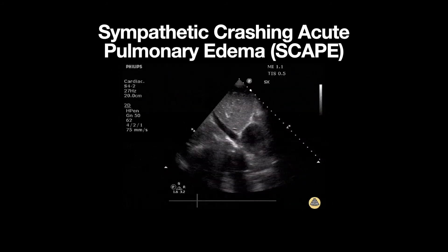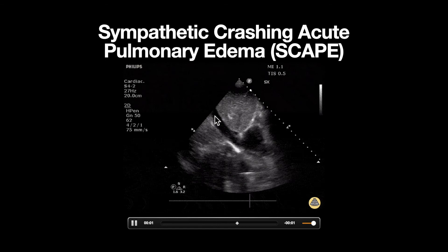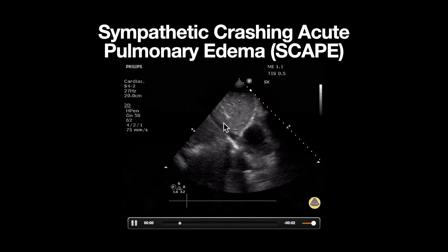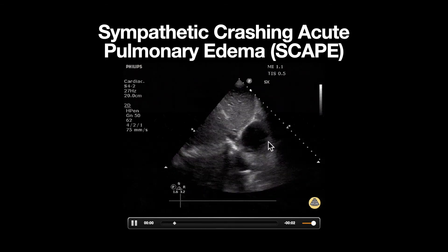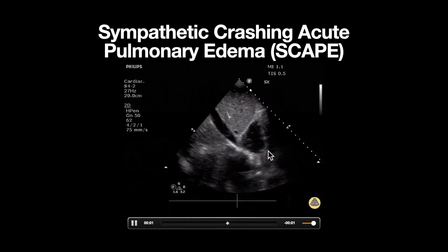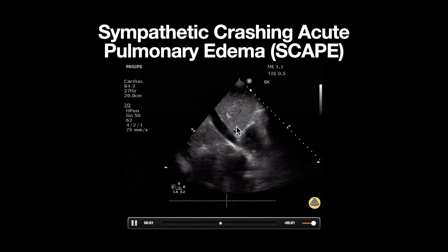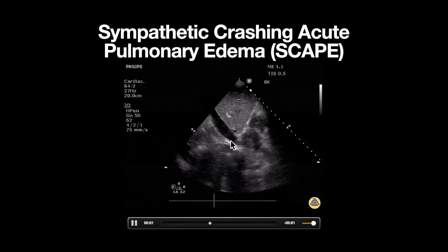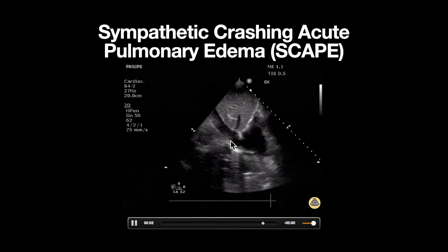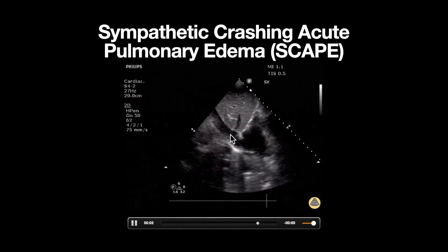Lastly, let's look at the IVC. This is a long axis view of our IVC, which can be seen here diving through the liver and connecting to our right atrium. Our hepatic vein can be seen here. Overall, this IVC does not appear significantly plethoric, and there also appears to be some respiratory variation.